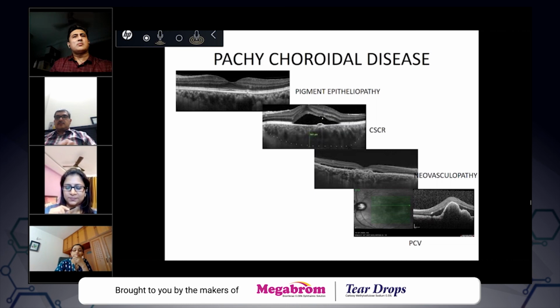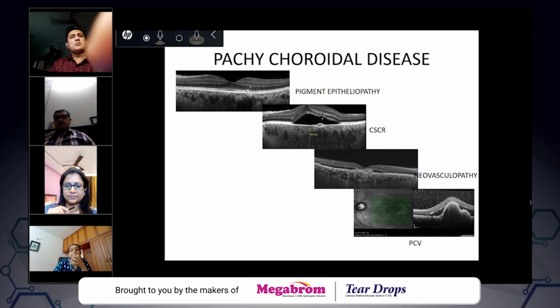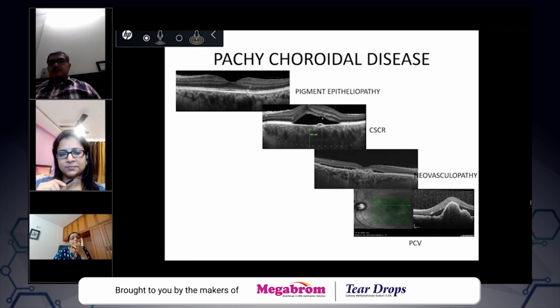So I just want to tell you again this. You are seeing a lot of our residents also seeing a lot of cystoid macular patient. Every patient is in for OCT. But actually, whether it is necessary or not, I don't know, because you have clinical evidence. Similarly, in your sympathetic ophthalmia case, you will have the evidence of the history of injury to this patient.